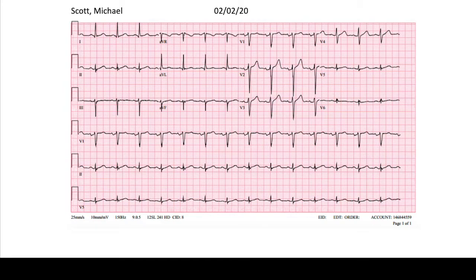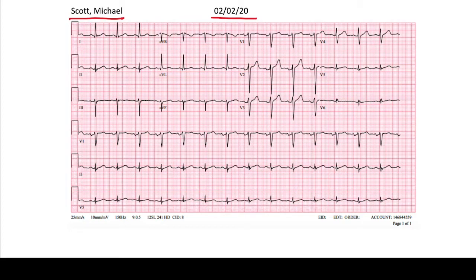Now that we know how to place the leads, let's look at an EKG. The first thing you should always do when reading an EKG is look at the name and the date. It seems super simple, but it's very important. On the cardiology service, you'll be following at least five to ten patients and each of them may have multiple EKGs. What can happen — and this has happened to me — is that you present an EKG and say there's a STEMI on it, but in reality it's a stone-cold normal EKG because it's the wrong patient or wrong date. It's fine if that happens, but it can be avoided if you start by checking the name and date.